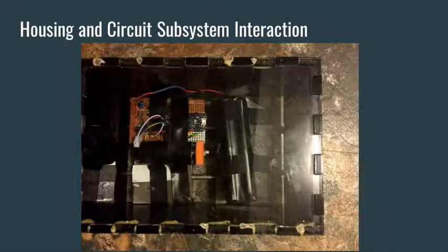The electrical tape also serves as a protective material for the circuit subsystem itself, so that if there were any external particles such as food or saliva to slip through the biocompatible shield, it would not interfere with the circuit subsystem's job, and so it would not cause the circuit subsystem to short circuit or malfunction.